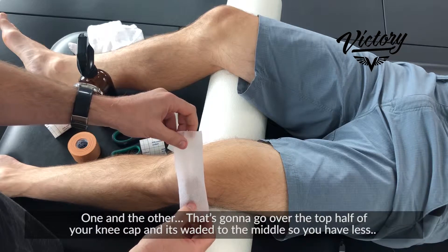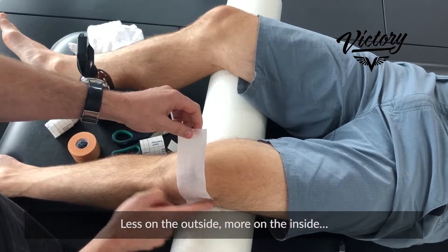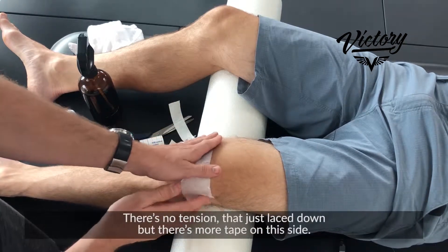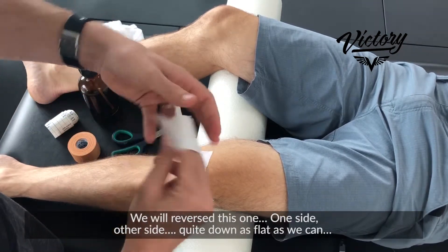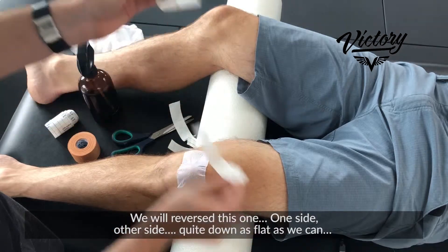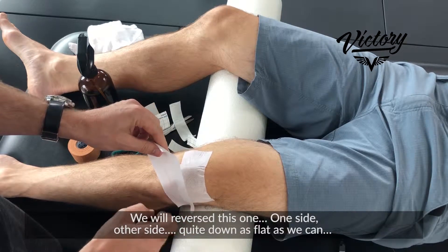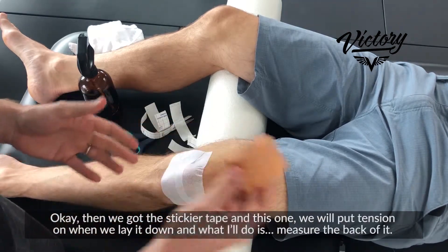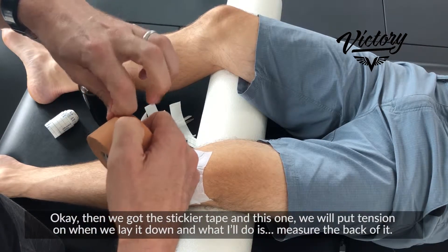Because it curls, we're gonna opposite-curl it. It's gonna go over the top half of your kneecap, weighted to the middle — so you have less on the outside, more on the inside. There's no tension; this just lays down. Lay it as flat as we can — one side, then the other.